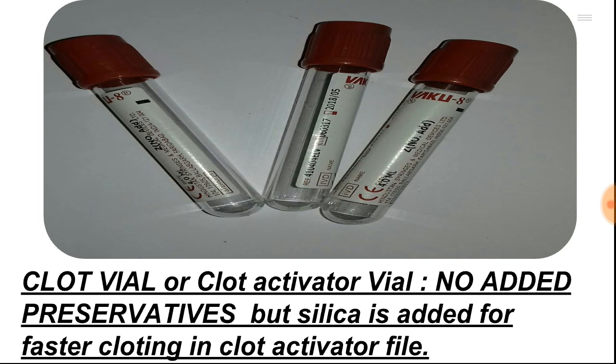Next is the clot vial, or clot activator vial, shown in the picture. No preservative is added, but silica or some ions are added for faster clotting in the clot activator vial. The color is red.